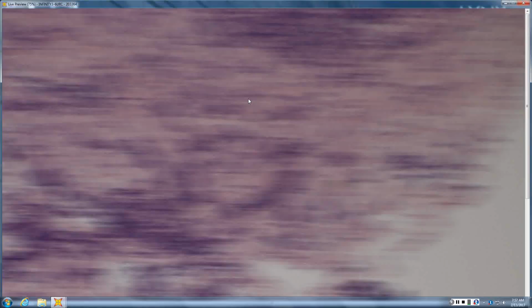So anything you want to do with it? Imagine this would get a fair share of stains. So you'd probably want to get stains. Start with things like a keratin 20.